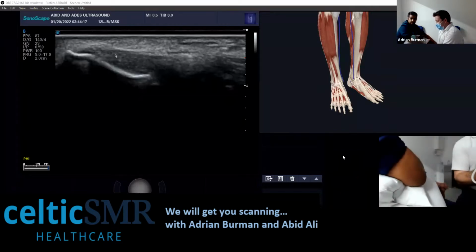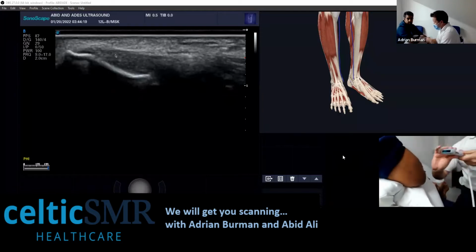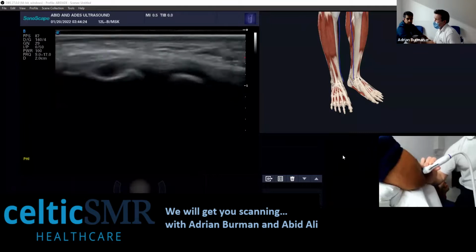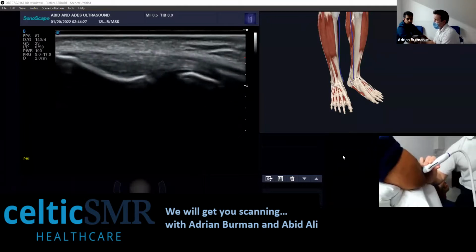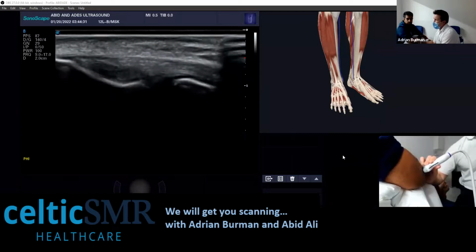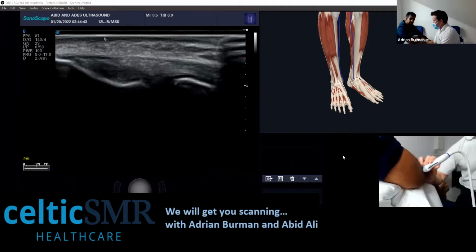And if you want to test that, then I suggest you get a big stand-off of gel. Rest your probe on there, and as you release the pressure, you should get a real sense of a little bit of stand-off gel at the top here, and then you really know that you haven't got so much pressure. So a nice layer of jelly should be quite easy to see at the top of the picture before you get to the skin.